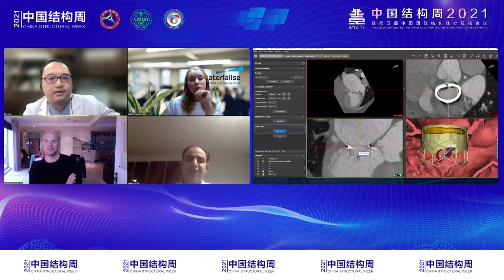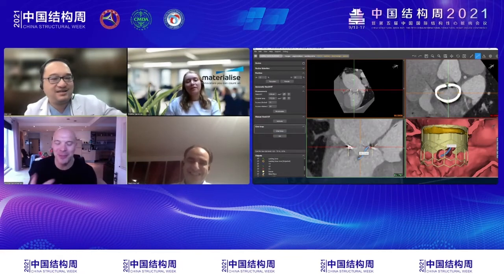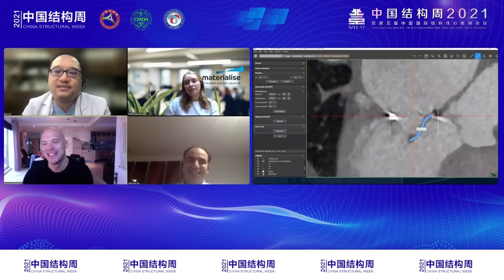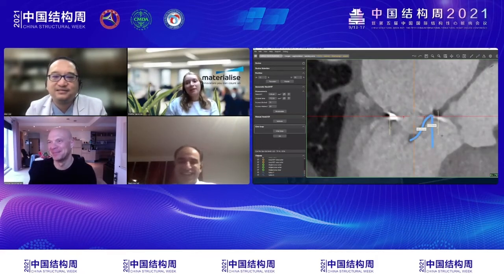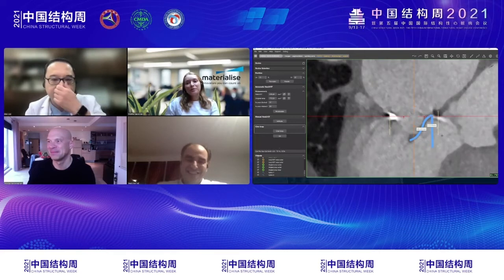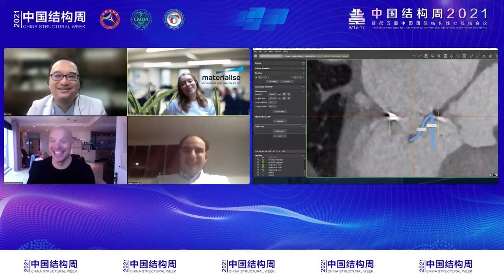But this is future. I know, but that's what we're doing. We're looking at potential future. We have to say always future is now, so we have to push. It's the same with the previous technology. Yeah. And after this, you will have to simulate the Lampoon also. Yes, that's also true.